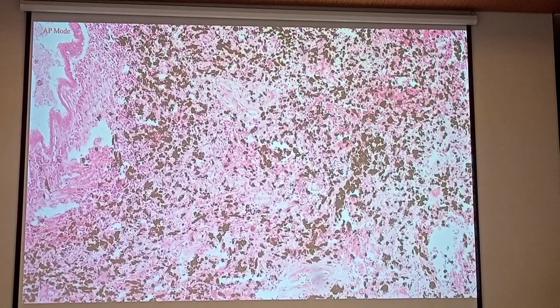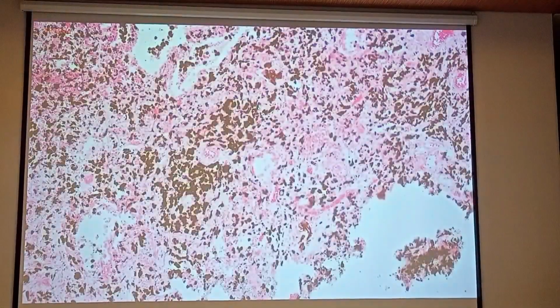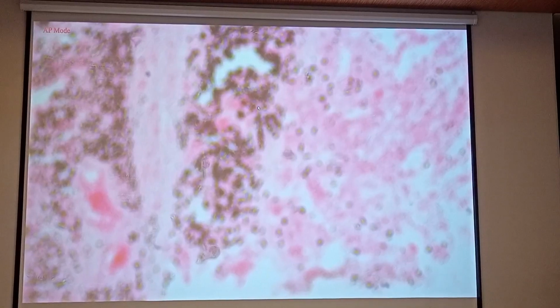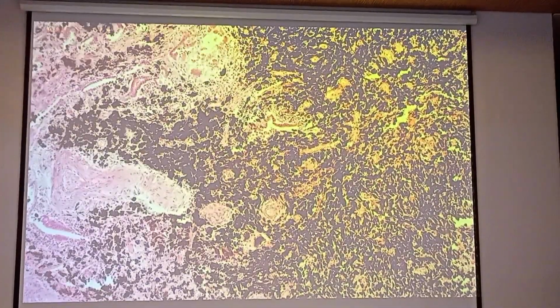And you can see these spindle-shaped cells. These are your fibroblasts. Actively secreting the collagen fibers, depositing the fibrotic tissue all the time. And look at these cells. So these cells also remain intensely activated. Why? Because they try to eliminate something which they cannot.